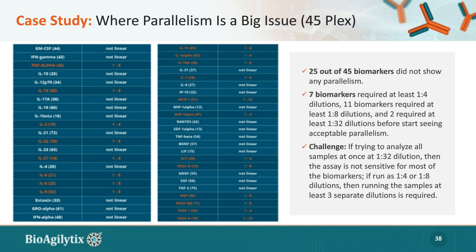Just the biology of the interaction and crosstalk between these antibodies makes it very different. So from a technology and platform perspective, it might be very nice, and it's doable to go to very large plexes. But from a biological perspective and the molecular interaction that we deal with, that is something that can become problematic. It doesn't mean the large plexes are bad. It's just that we have to be careful with them.